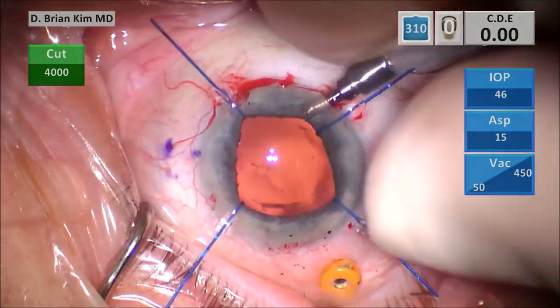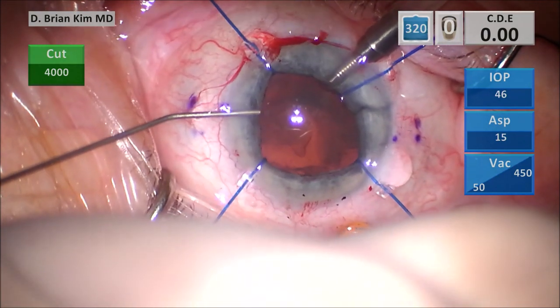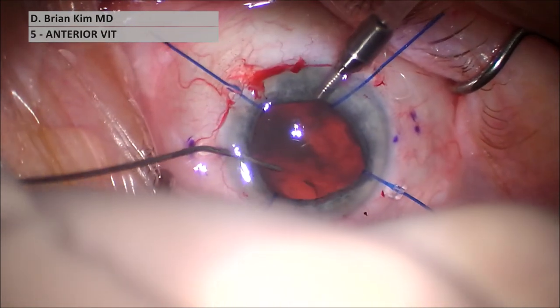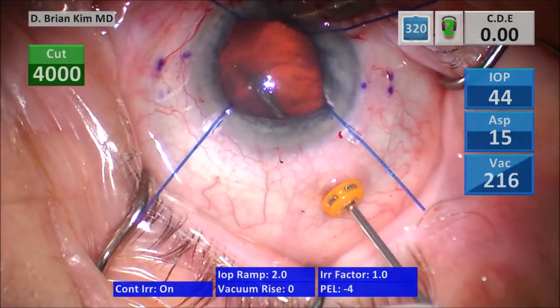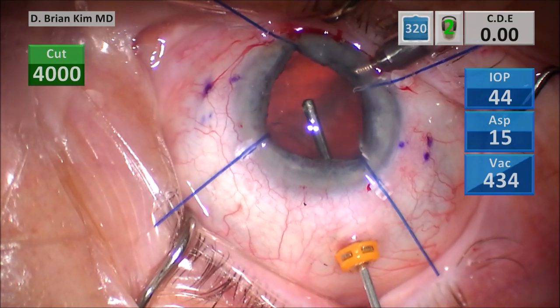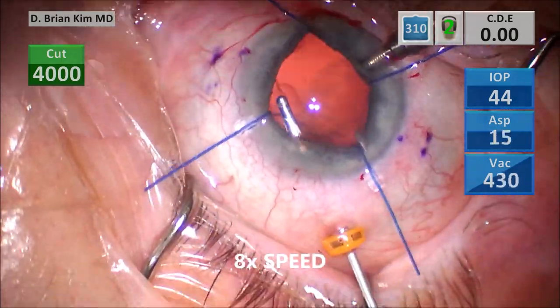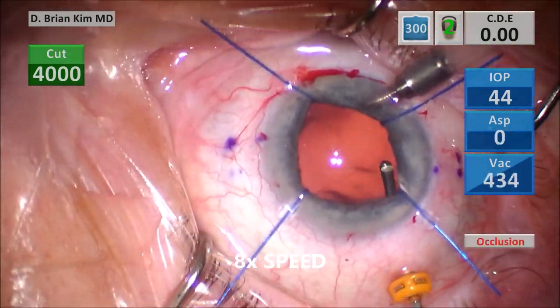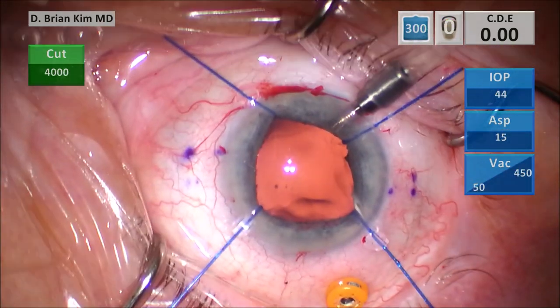I'm placing the 20-gauge Lewicki AC maintainer. This is intracameral triamcinolone, which will highlight any potential vitreous in the anterior chamber. Since vitreous is invisible, staining it with triamcinolone is very helpful. Going through the trocar and now doing the anterior vitrectomy. You really want to do a thorough anterior vitrectomy, making sure you remove any vitreous in the anterior vitreous space, anywhere the lens and haptics will be. Iris hooks are really helpful here — I'm getting right underneath the iris, doing vitrectomy right below where I'm going to be placing my scleral needles.